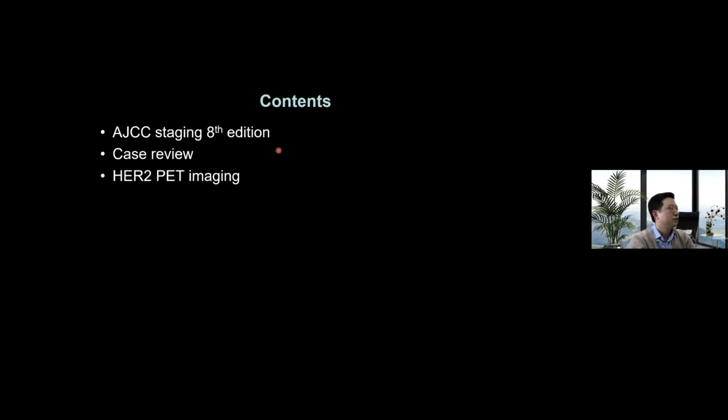And HER2 PET imaging is included in today's talk because it's one of the emerging molecular imaging areas in breast cancer. And I found that in breast cancer, there is not a lot to say about correlative imaging. So I included that part today. So hope you enjoy it.